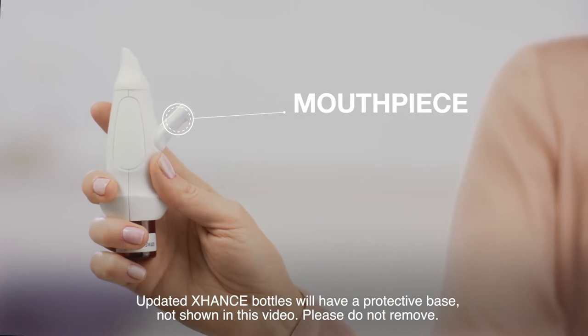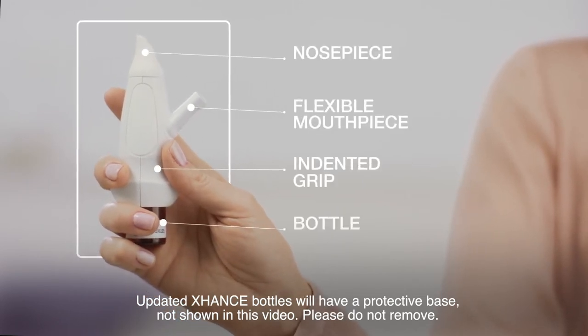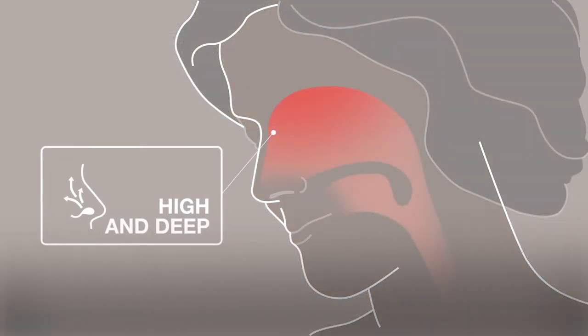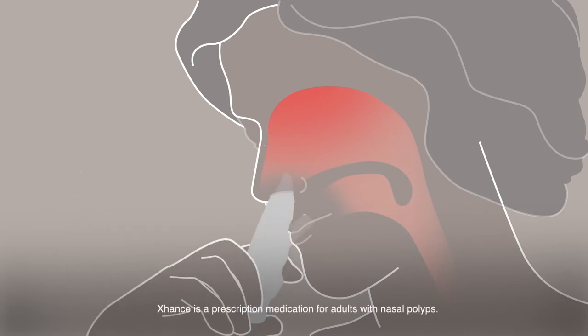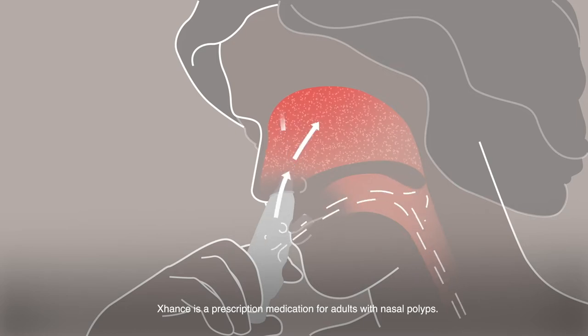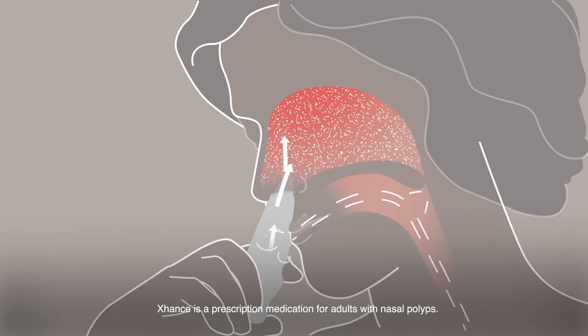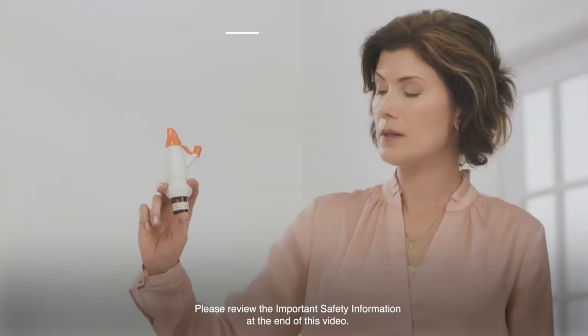A mouthpiece? Well, that's different. And for good reason. Nasal polyps originate on inflamed tissue, high and deep in the nasal passages where sinuses drain. It can be hard to get medication that high and that deep. XHANCE is a different kind of nasal spray. You blow and don't sniff. With XHANCE, your breath helps deliver medicine high and deep into your nasal passages to areas of inflamed tissue where nasal polyps originate and sinuses drain. This may give you the relief you're seeking.